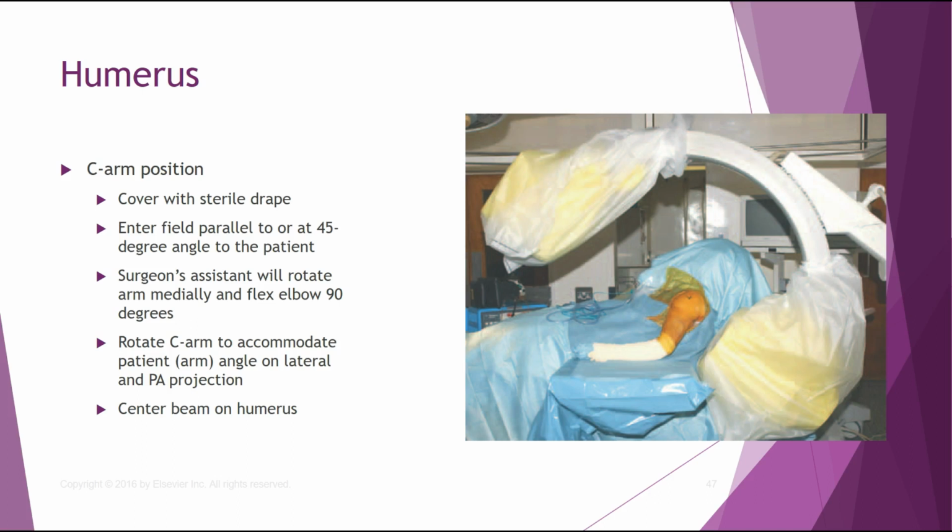You're going to enter the field parallel to or at a 45-degree angle to the patient. Okay, and that's just because their arm is out. So the patient is, from head to toe, their arm is now out of that field. So you're going to enter in perpendicular to their arm, okay?